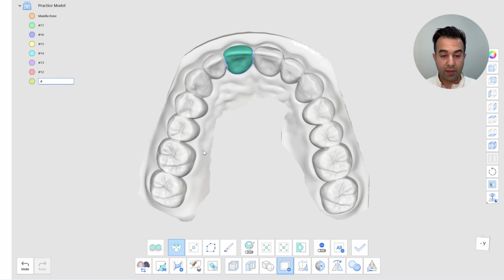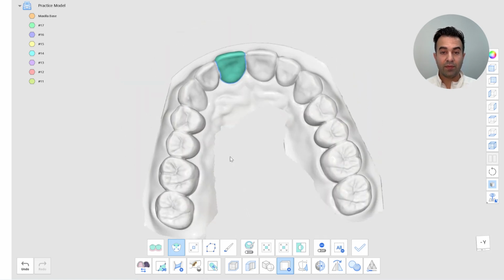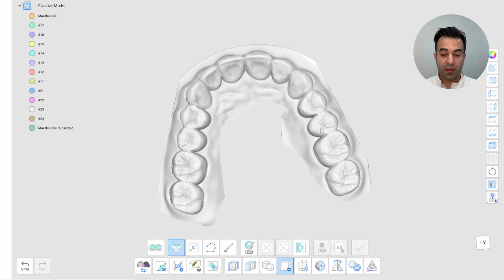Technically, we are duplicating the individual meshes of these 14 teeth. And that is our second step of obtaining a 3D teeth library. And here I did speed up the process to 2x, as it will be repeated exactly the same thing. You can see on the premolar I had to click the mouse twice, and still the software managed to select the entire tooth in 2 clicks.